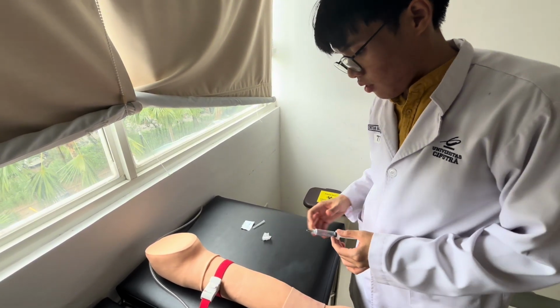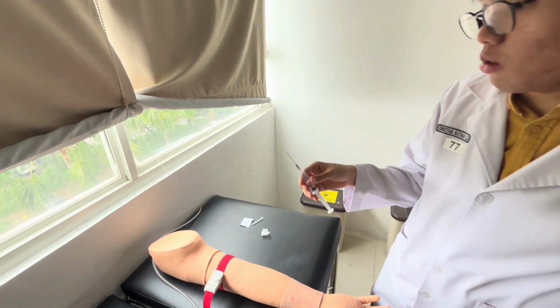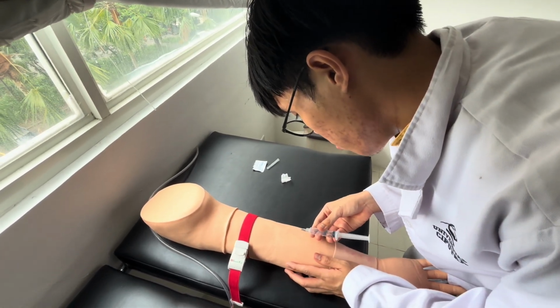Okay. And I will make sure that the needle is facing upwards, so the hole will be facing upwards, not downwards. And now I will inject it into the vein. Excuse me, sir, this may be slightly painful.